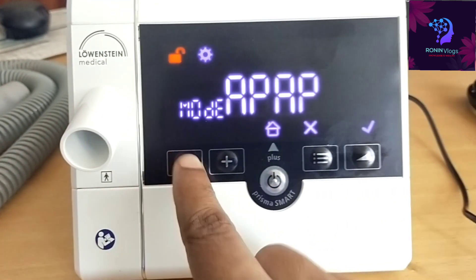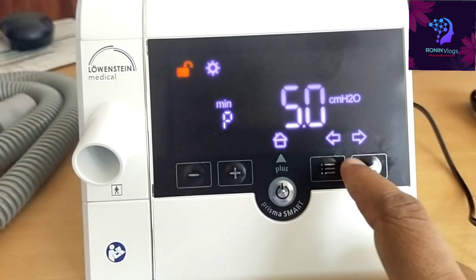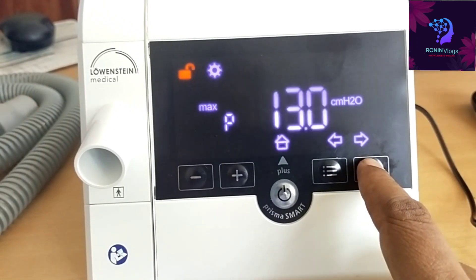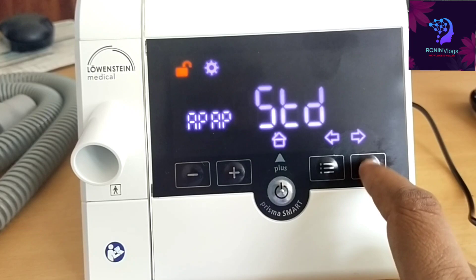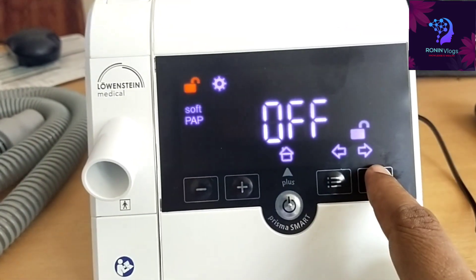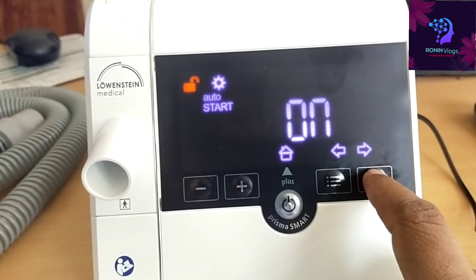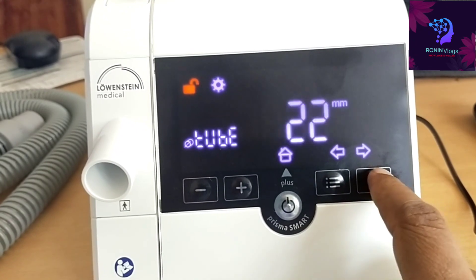Now we go to the APAP mode because we need to select the maximum and minimum range. The maximum range is set to 13 and the minimum range is near 5. In between these values, the machine will manage the pressure to deliver to the patient. For other settings, no need to change — just press the menu button.